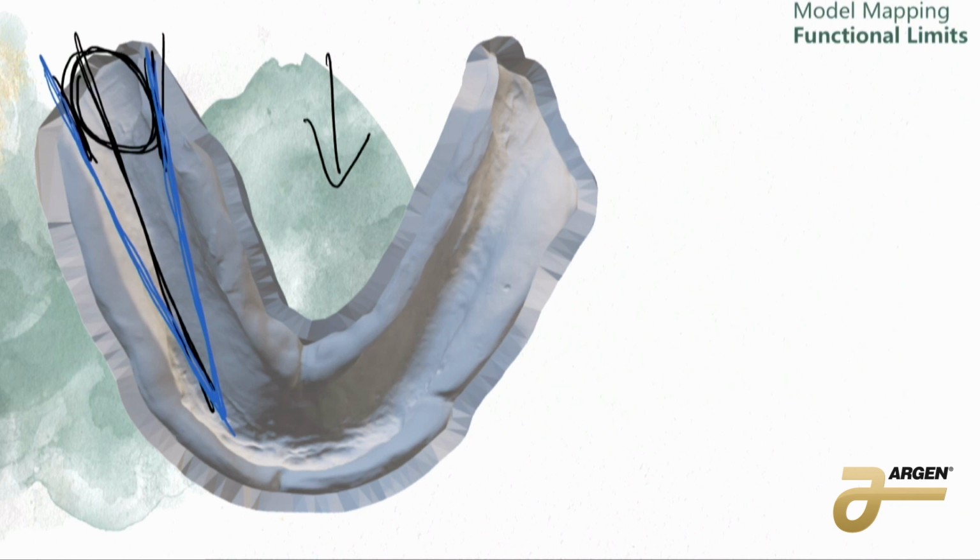If you have a really atrophic ridge, so they have tons of bone loss and they have a flat ridge, they still have something under there that's going to be a little stronger and a little squishier. So it's still important to find that midline, but it might be a little more difficult. So what you can do is kind of go into the depth-ish of the sulcus on one side, the depth on the other side, measure that distance, and find the midway point. And you can do that all along your ridge, measure the distance, find the midway point, and then just connect those dots. So you still can find the center of the ridge, even if it's really flat, and I still suggest that you do because there's still some bone in there. It's just covered by a lot of tissue.